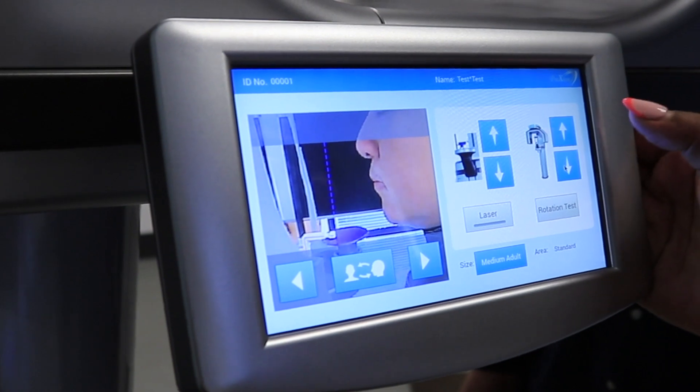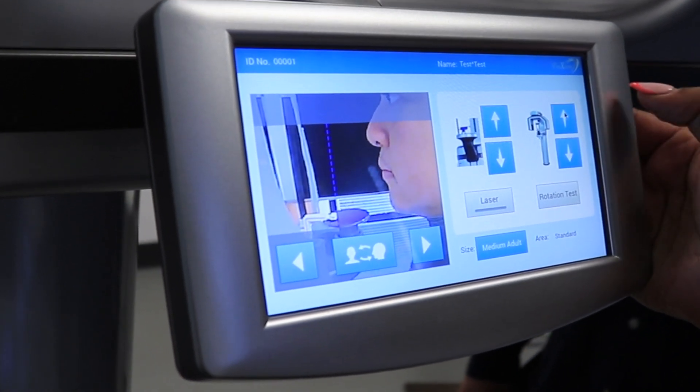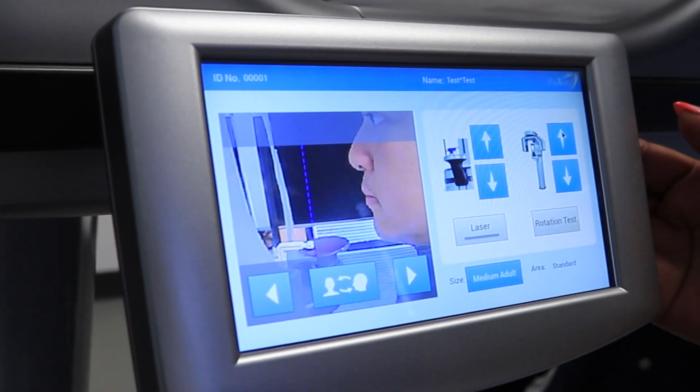On the small console screen, use the gantry arrows to adjust the machine to the patient's height. Adjust the gantry until the chin rest disc is level to the patient's mandible.